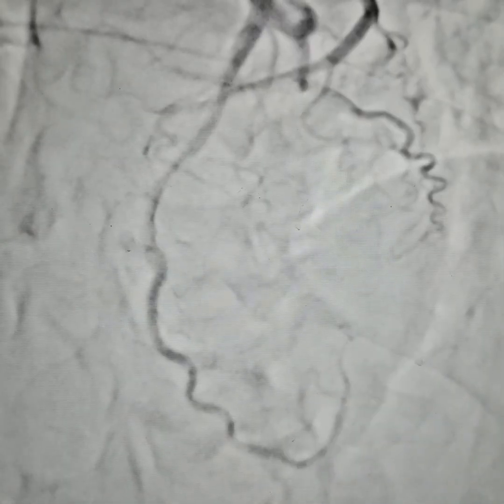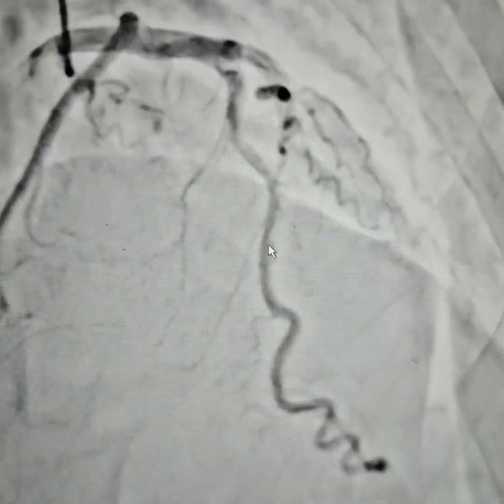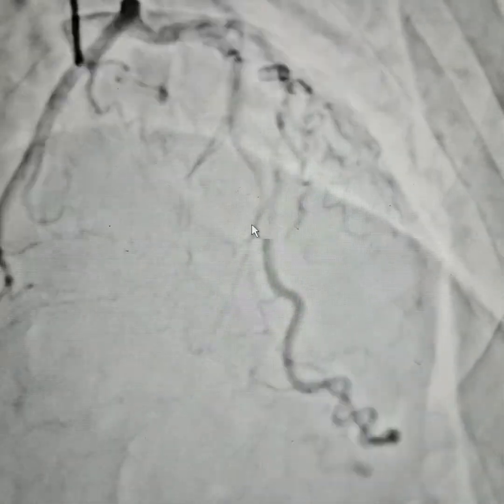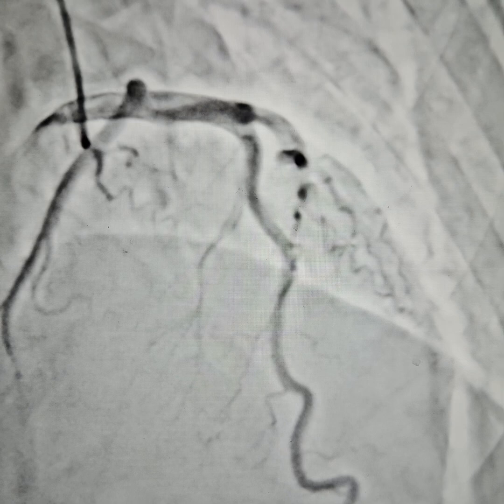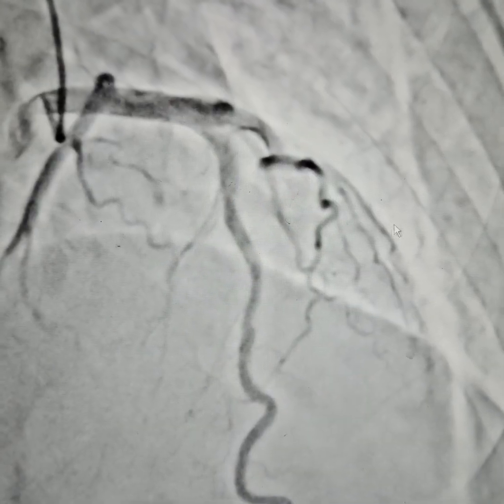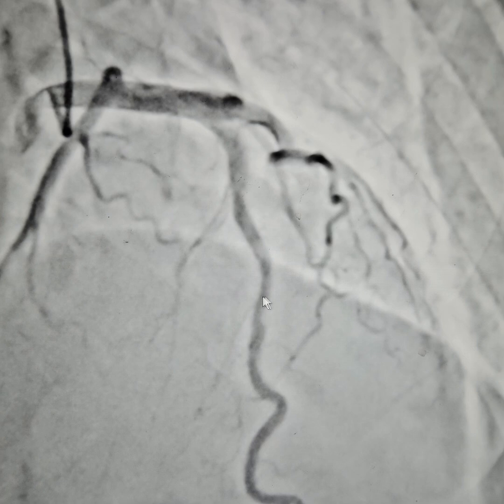This is the dominant LCX. Now concentrate here — it is getting compressed, it does get compressed and then gets released. You can see this is the calibre, and this is the myocardial bridge.